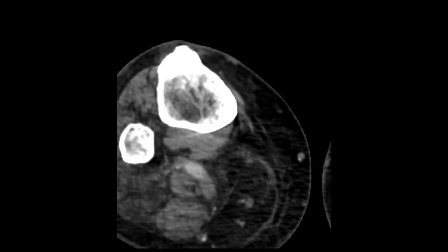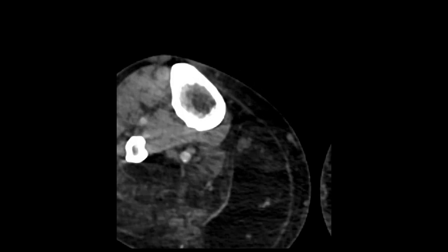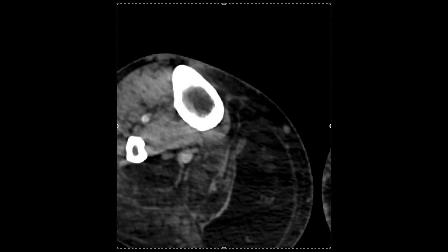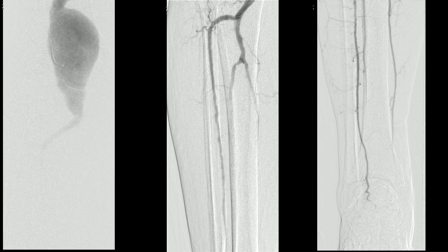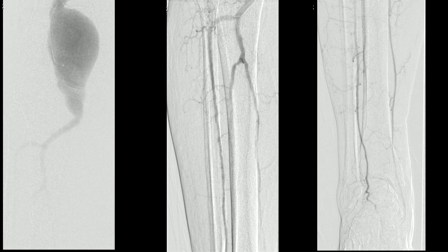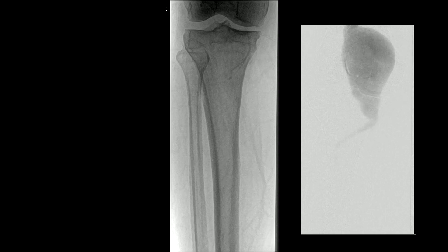The important thing on the pre-op CT scan is to evaluate whether there are proximal or distal landing zones you can actually utilize. Before we get into the operating hybrid suite, we can see catheters in the aneurysm and a fairly nice popliteal segment right above where the anterior tibial comes off. We've also looked at the runoff — we need to make measurements using a combination of CT scan and angiogram.